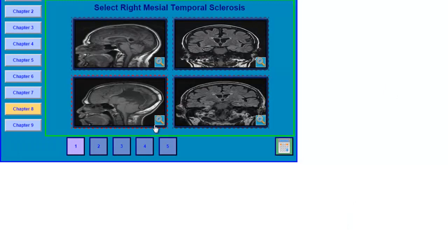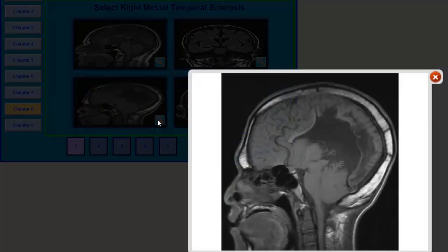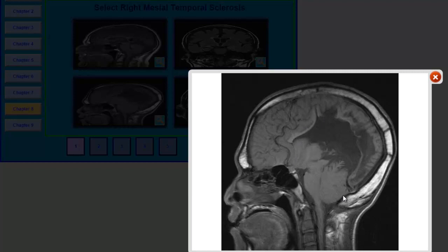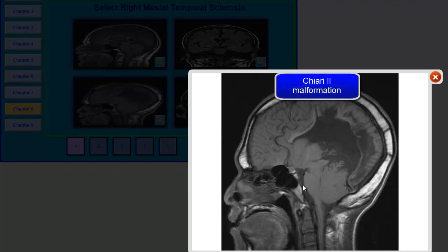What about this image? This is a patient with a poorly developed corpus callosum — there is partial agenesis of the corpus callosum. There is also some herniation of the cerebellar tonsil. This is a patient with Chiari type II malformation.